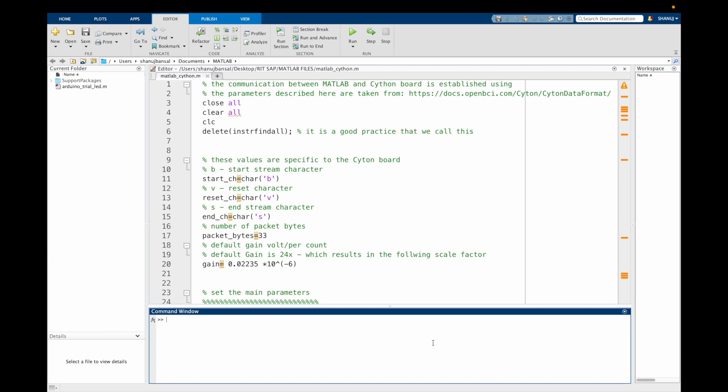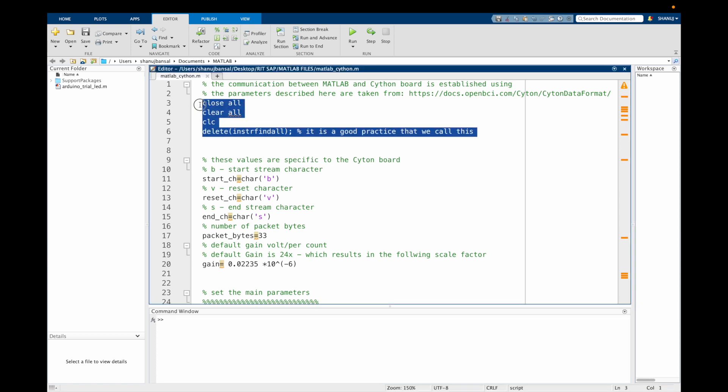Here we have tried to build a code with simple signal processing, which tends to do really well. Most of the data is taken from the Cyton datasheet, available on the OpenBCI website. Let's begin with the code itself. First we call functions such as clc, close all, etc., as it's good practice to call them.